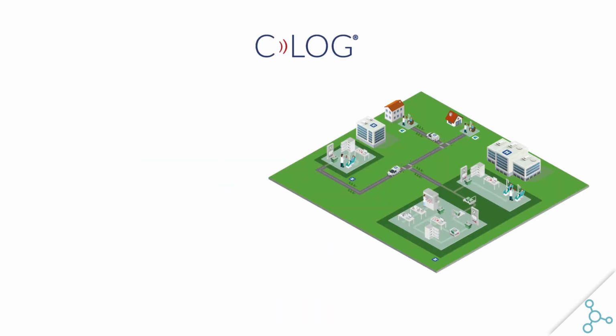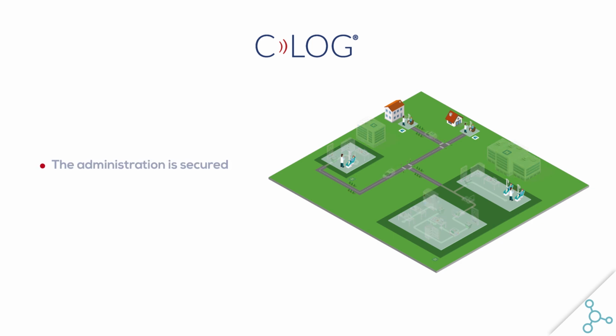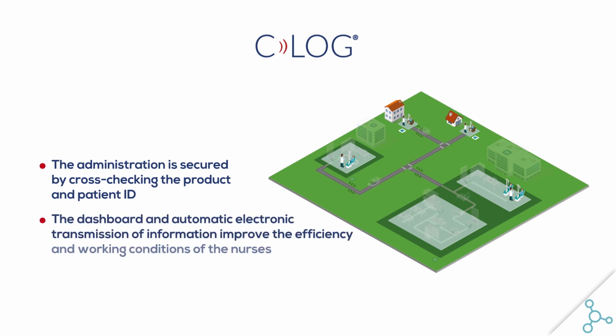In summary, thanks to X-Match, the administration is secured by cross-checking the product and patient ID. The dashboard and automatic electronic transmission of information improve the efficiency and working conditions of the nurses.